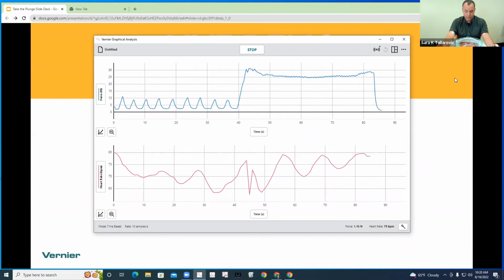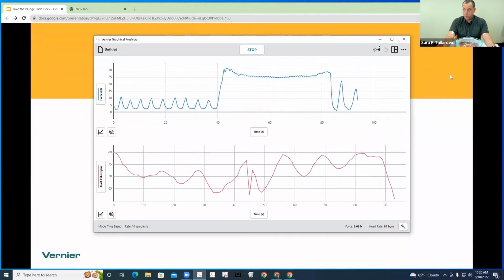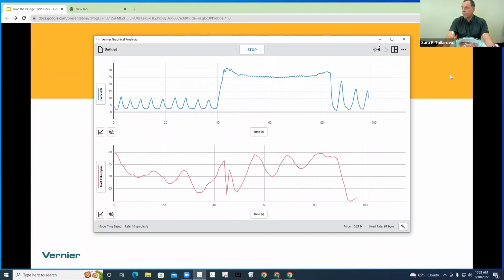All right, so John has let his breath out. I'm going to give a little bit of time just to collect a few more data points. See some recovery breaths there as he breathes a larger volume for a little while. All right, and then we can stop data early. We don't need to necessarily go the full 120 seconds.